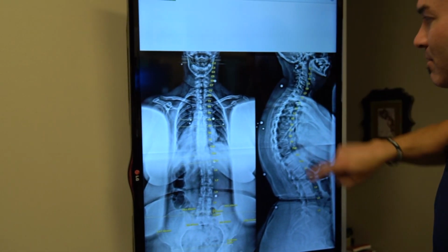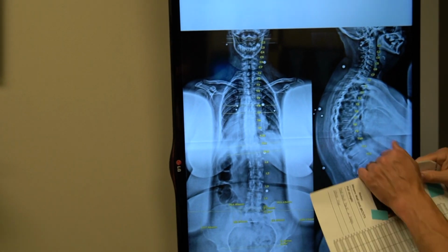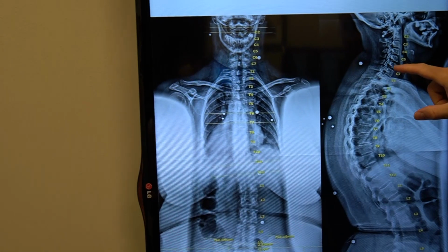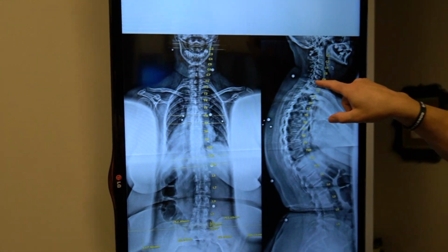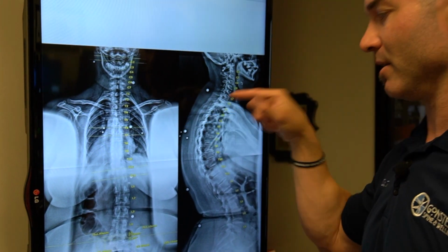Well, there are certain segments in the spine that we adjusted. Her 6 cervical is very extended, meaning it sits back like this. And in the traditional Gonstead analysis, you'd look at this on x-ray and say, oh, that might be a problem. But in the Gonstead work, we don't just look at an x-ray and adjust off the x-ray. We find the problem on the patient.